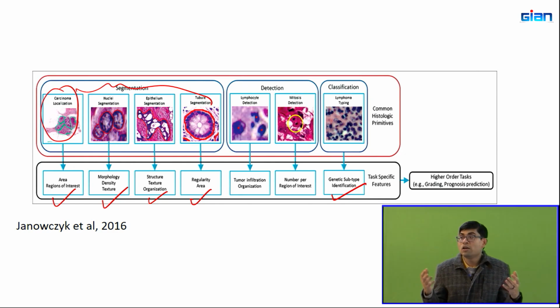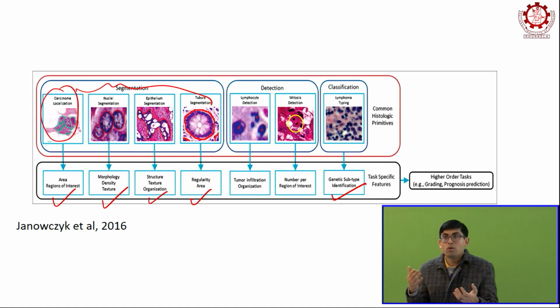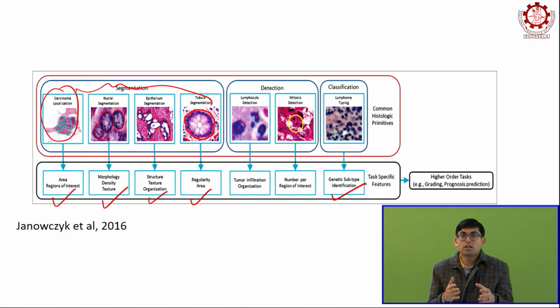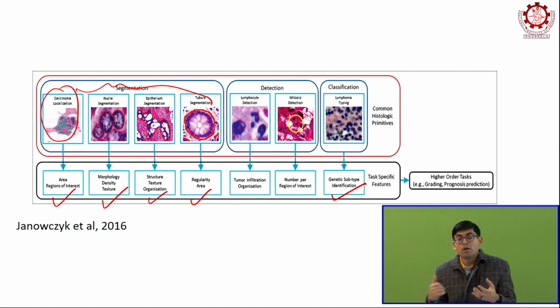Now imagine if we can have an AI model that can just take the image and perform this subtyping and give you the results. So the doctors can look at these results, and to a certain extent, if this is correct with high certainty, then you can immediately start treatment and not have to wait for the results of the genomic analysis to come back, right?